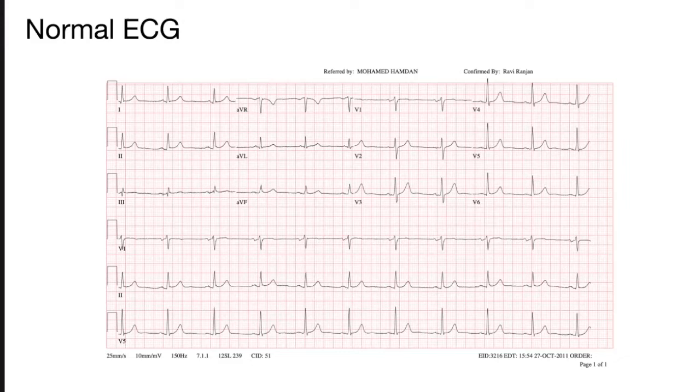So Ben, can you annotate where the P wave is? Maybe annotate a few. Pick another one. Does everybody agree with Ben? Anybody disagree? Great. So you can see that depending on what leads you're looking at, the P wave is going to appear differently. If you can't see it in one lead, I would highly recommend checking a different lead to see if it's a little bit more obvious.